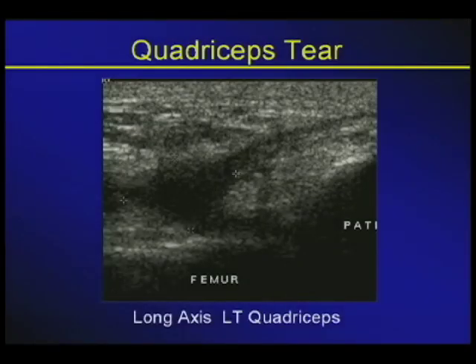When you have a tear, the fibrillar pattern is completely disrupted. Here you see in a long axis view where you were expecting some fibrillar patterns, a hypoechoic cleft transecting all the way from the bony acoustic landmark of the femur to well above the bony acoustic landmark of the base of the patella, representing fluid tracking through the suprapatellar recess across the tear of the quadriceps tendon into the prefemoral portion. Note the relatively preserved suprapatellar fat pad.